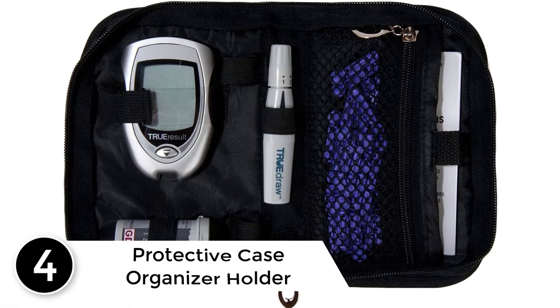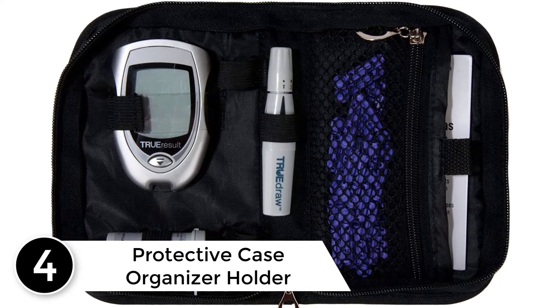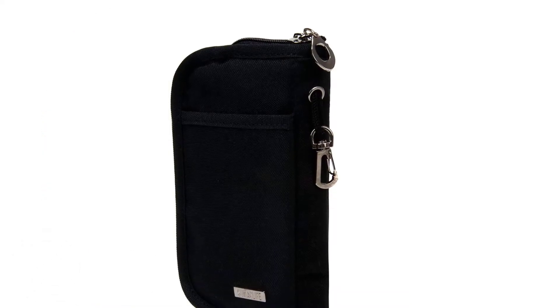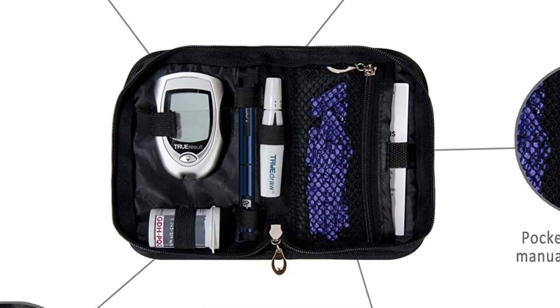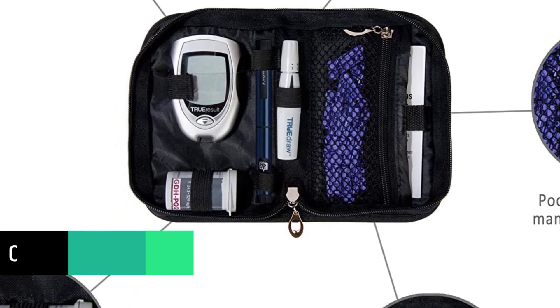At number 4: Protective Case Organizer Holder for Diabetic Supplies Diabetes Testing Kit. This case is durable, dustproof and waterproof to protect your supplies. Classic zipper convenience for easy opening and closing. Lightweight diabetic supplies bag ensures the best protection for all of your supplies in the diabetic travel case. Its lightweight allows you to easily bring it anywhere without trouble.